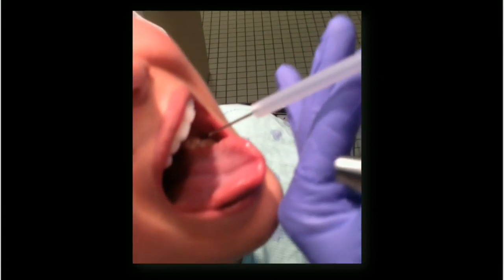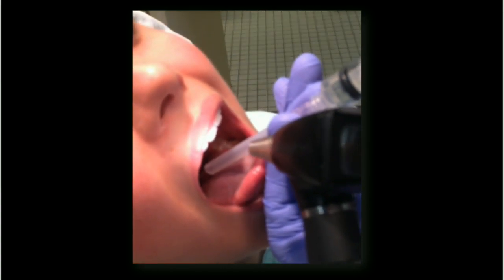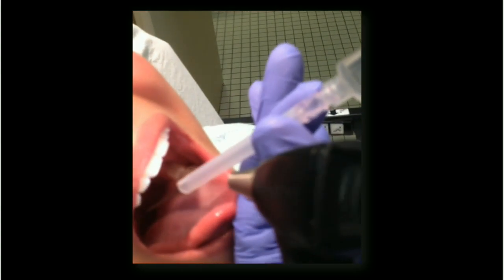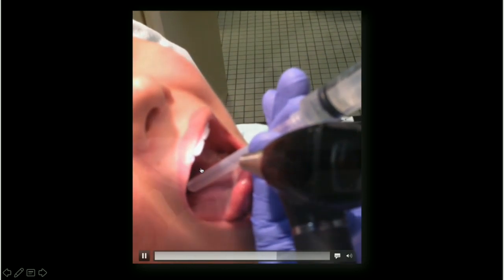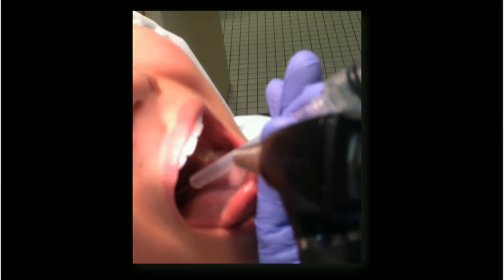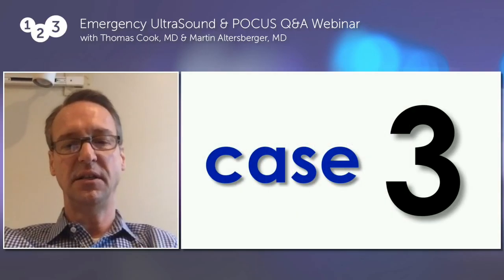So this is a young woman. She's a college student. She has a peritonsillar abscess. We've already figured out where it is on ultrasound. You can see the cover on the needle. And here you can see we've aspirated out that pus. See the cover over the needle? We can't get too deep with her. We can't cause any problem with the carotid artery. She's a very cooperative patient, and we aspirated out about 4 or 5 cc's of pus. We gave her some steroids and some antibiotics. She felt much better. We sent her home and she came back the next day, and she just did fantastic and was completely fine in about 48 hours.